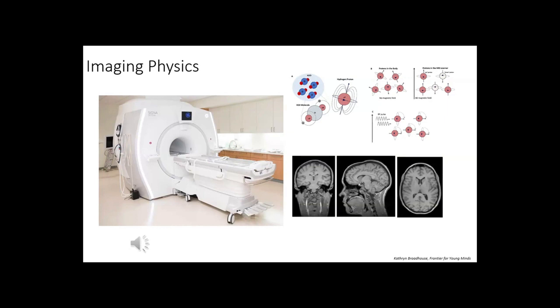Next lecture, Dr. Stanley will come to talk about DWI, a more advanced technology. Basically, we can measure the fibers and how these regions are connected to one another. So this is the very basic physics of medical MRI: a big magnet, and all the molecules are halfway south-north and halfway north-south.